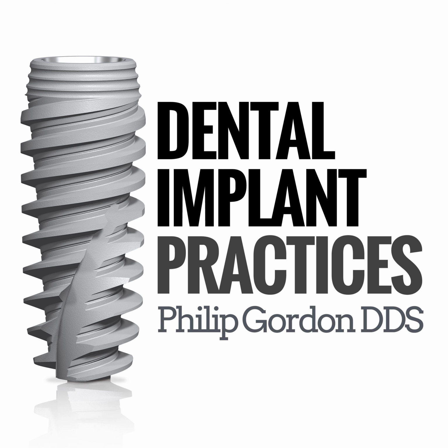And let's say we're doing a 4 millimeter diameter by 11 millimeter long implant in our panoramic-based plan, we'd always have a narrower implant standing by, we'd have a wider implant standing by, we'd have a shorter implant standing by, we'd have a longer implant standing by, just in case we got in there and we had to modify things a bit.